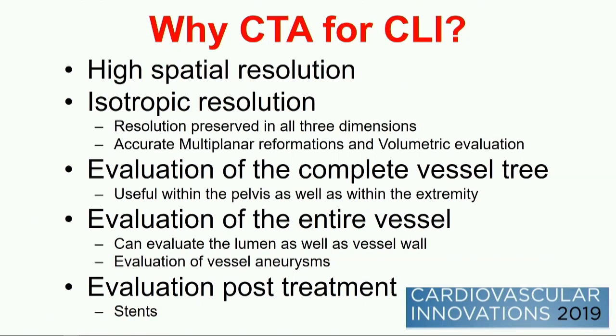It gives us images and voxels or points that, any way I look at them, retain their measurement and their fidelity, so that I can do reconstructions in multiple different ways, whether they're curved planar reformations or what we call skewer views through the arteries, and really preserve that information. It allows me to look at the whole tree, not just the lumen, but is it calcified or not? Is there soft plaque? Give me some idea of positive remodeling. All these things are important a lot of times in the vessels that we treat. And then it gives me some idea to evaluate patients that have stents.